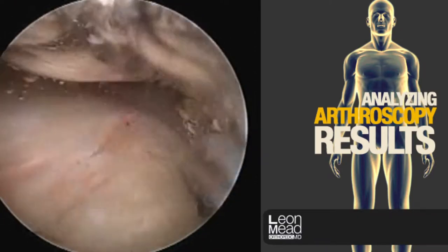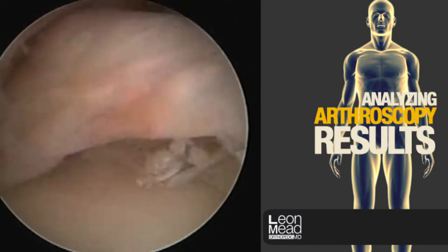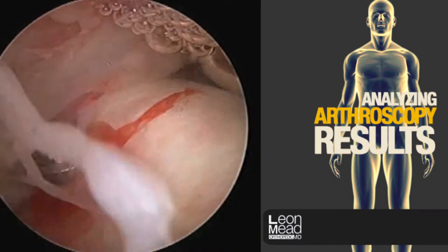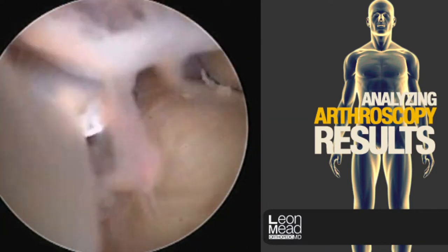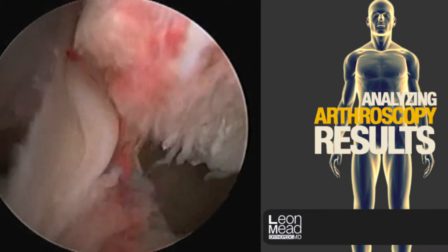We're now looking from the side view. The rotator cuff is this white band of tissue in the center of the screen. To the left is the back part of the shoulder where we've just inserted the shaver. The front is to the right. The flimsy tissue that we're removing is the bursal tissue.